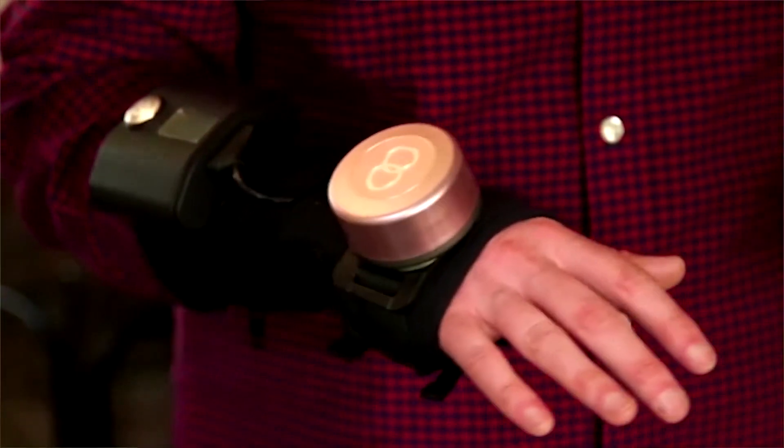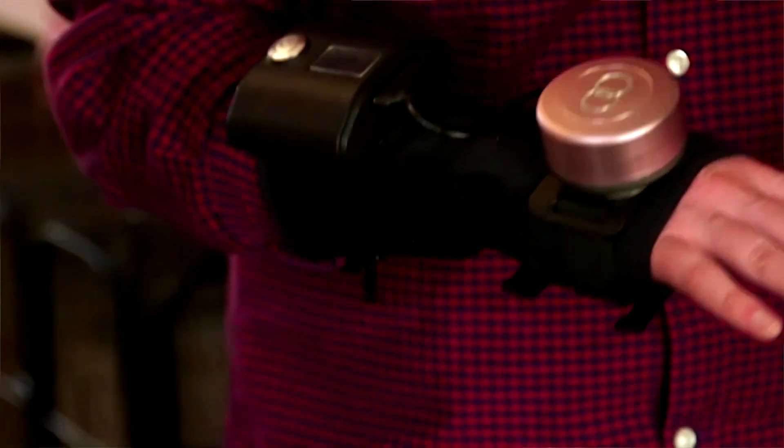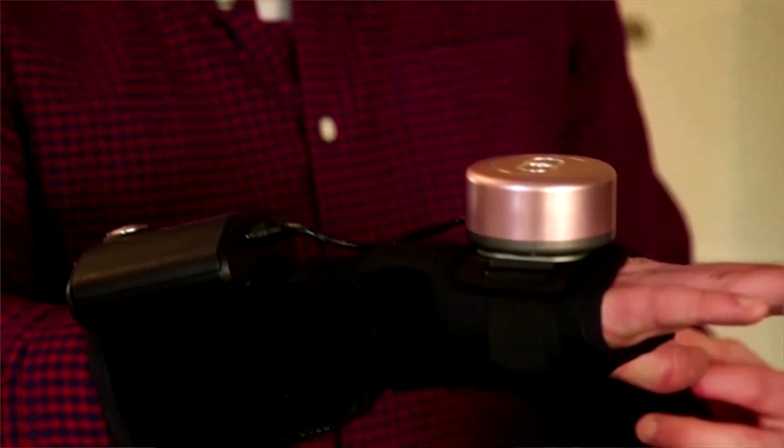The gyro glove essentially has what we call our little puck, which sits on the back of the hand. It is a spinning flywheel, and while that flywheel spins, it exerts a gyroscopic force. So much like a spinning top that will always stay upright as long as it's spinning, your hand will always stay level while the flywheel is spinning.